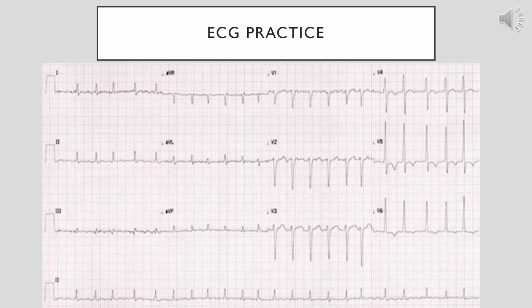For this EKG that we're looking at here, looking at the bottom long lead, that's lead 2, showing us a lot of beats per minute. Looking at the space between each complex, it's about 2 big squares, so 300 divided by 2, we're looking at a rate of about 150 beats per minute. As we see, there are some P complexes that are easily seen. Lead 1 really shows some of the chaos that's going on because this is atrial fibrillation. You can see in lead 1 there's a lot of shaky fibrillation, and there's a lot of P waves, and not all of them are getting through.